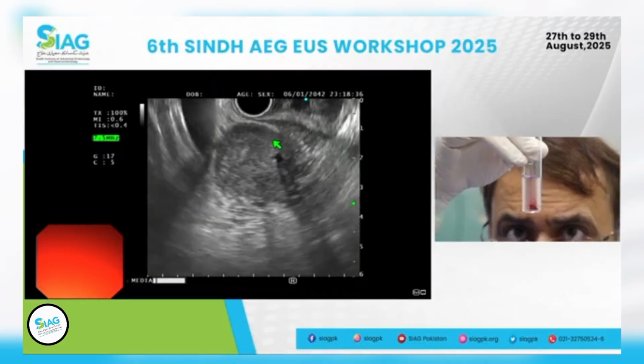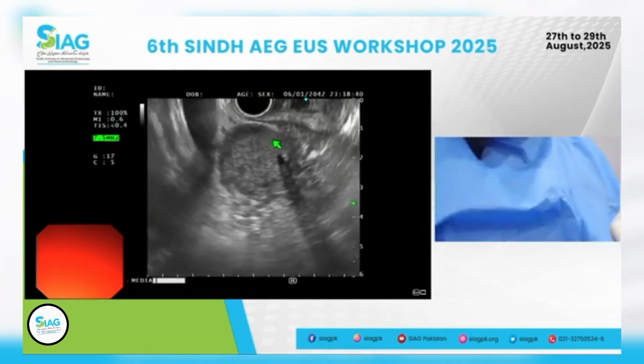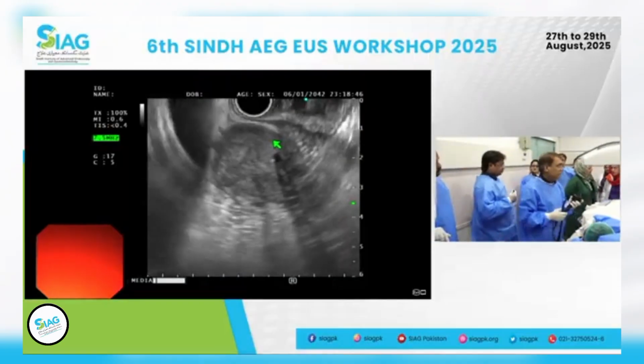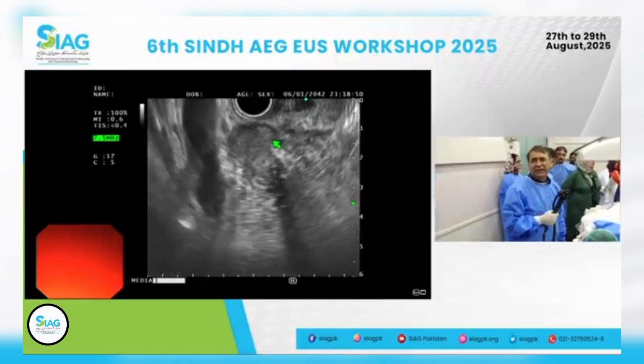I know you are making the slides for it? Not mine, sir. Yes? It is needed. Making slides? But I also want to see the macroscopic exterior of it. Should we wait or are we okay? It looks like we are okay.